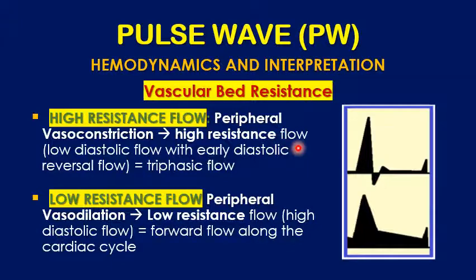So here we get what we call the diastole, as we mentioned earlier, because this is a low energy driving force. I will get the flow either at the baseline or a little above the baseline. But sometimes you also notice this area here, which is early diastolic reversal, another sign of high resistance arterioles. The arterioles at the very end of the artery, at the very end of the road, reflect over the flow of the main artery that you are scanning.